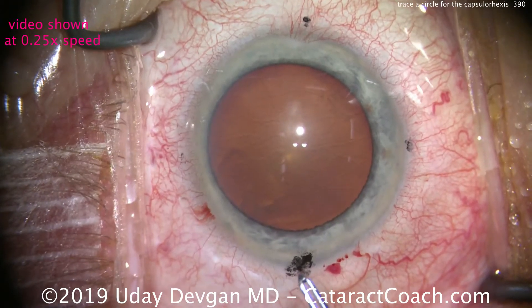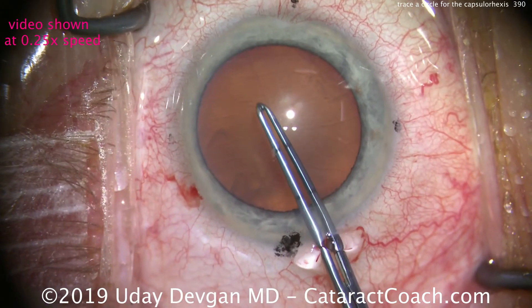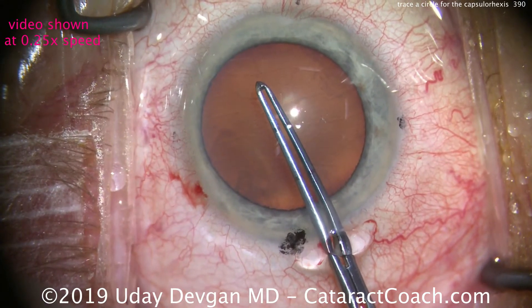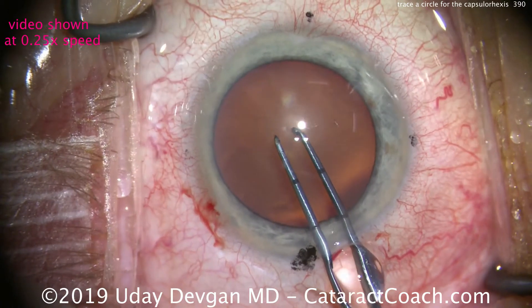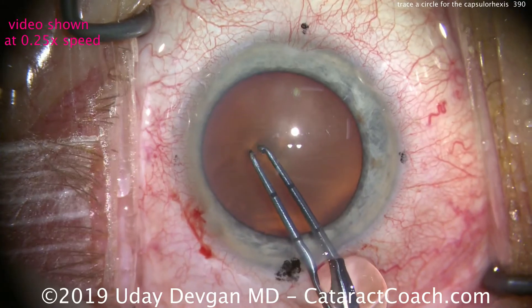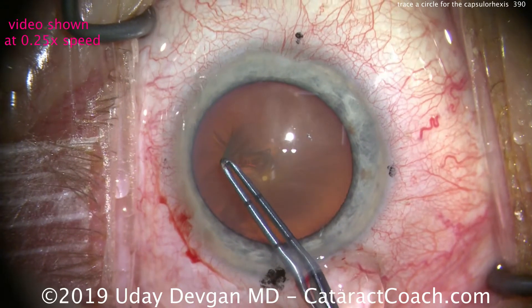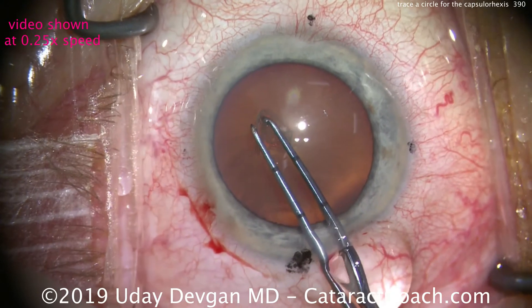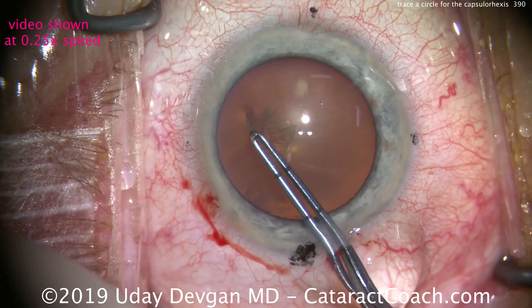Let's watch the same segment again at one quarter of normal speed. Going inside the eye, I first measure — that's about where I want the rhexis centered, about five millimeters. Poke in with one arm to puncture the anterior lens capsule, close the forceps, and now we're grabbing it. We start tearing, and the action is to move the tips of the forceps in a round circle.